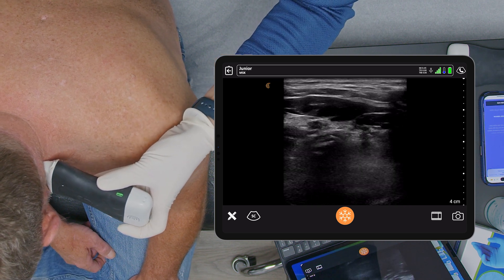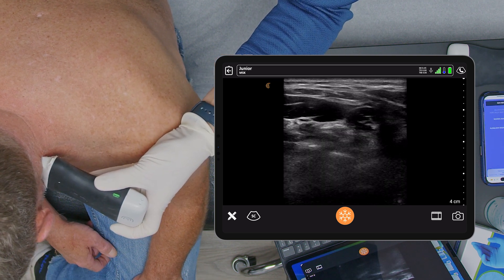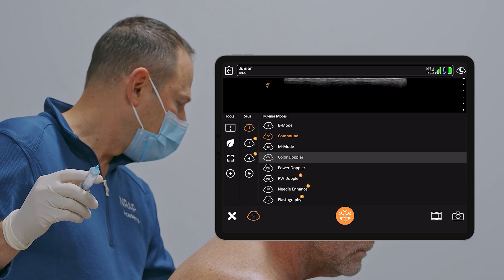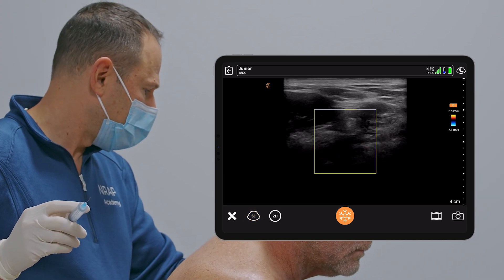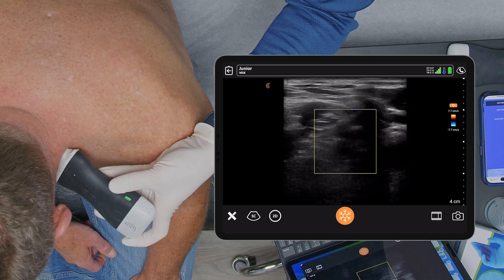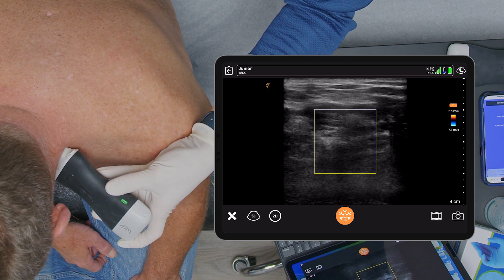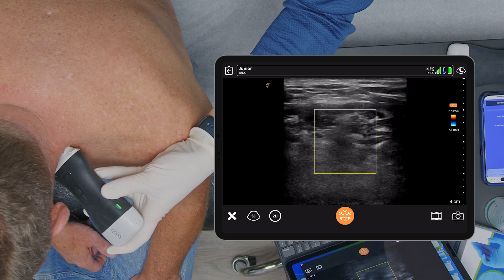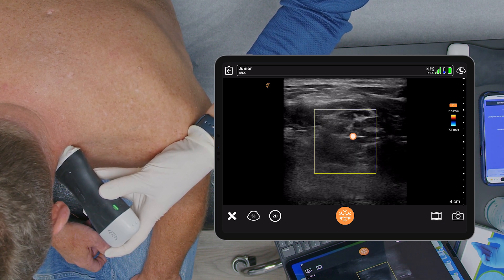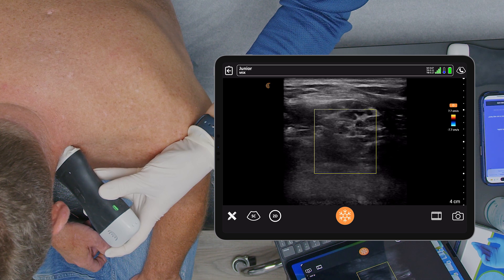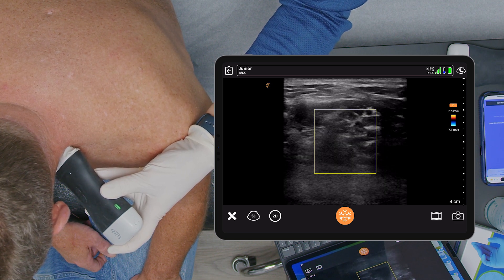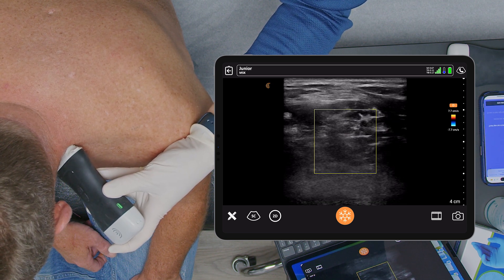Moving forward, I'm going to put the Doppler on to see if there are any blood vessels. There are no blood vessels in our way here. The hypoechoic circles are nerves. There is a blood vessel right next to one of the nerves, which we'll try to avoid.